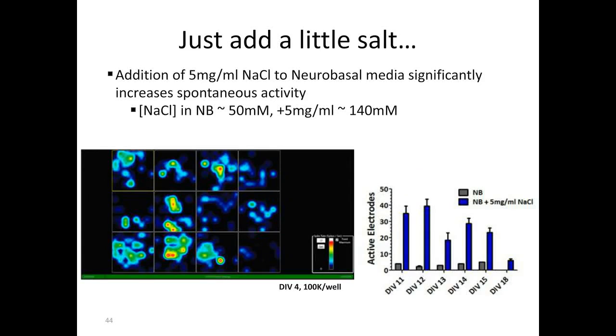And so really what it came down to was we just added a little salt to our cultures. And what we had noticed is that we were culturing in standard neurobasal medium. We were recording in neurobasal medium. And the sodium chloride concentration in neurobasal was relatively low compared to what is typically used in other artificial CSF preps or what's physiologically relevant.